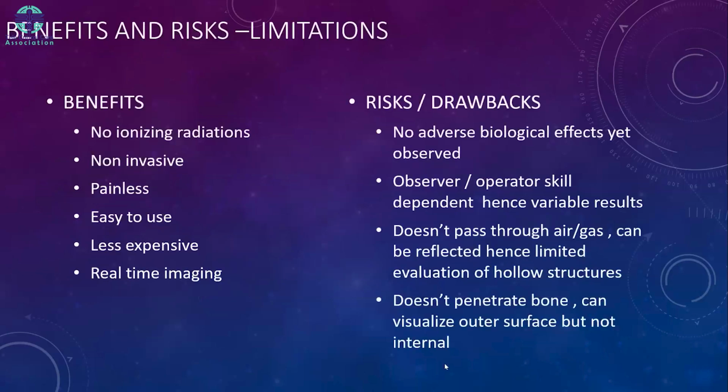Now the benefits and risks. Because there are no ionizing radiations, this is the best modality to visualize any of the structures. It is non-invasive, painless, easy to use, less expensive as compared to CT and MRI, and it is real-time imaging that can be done bedside also.